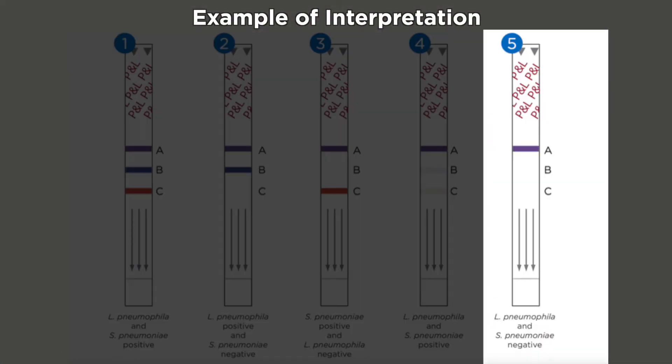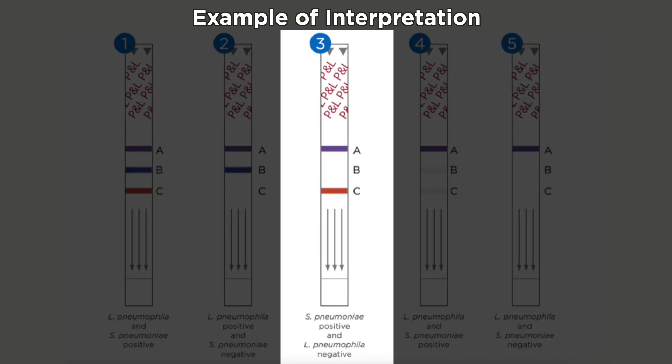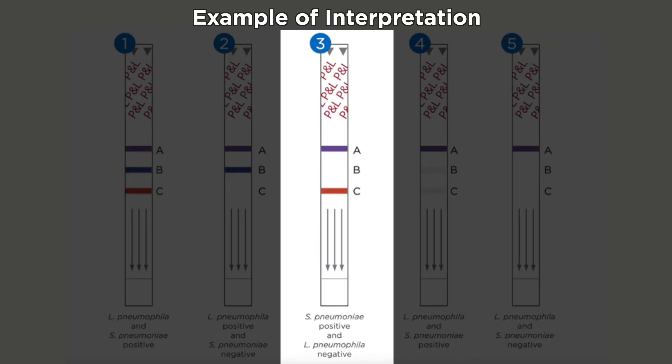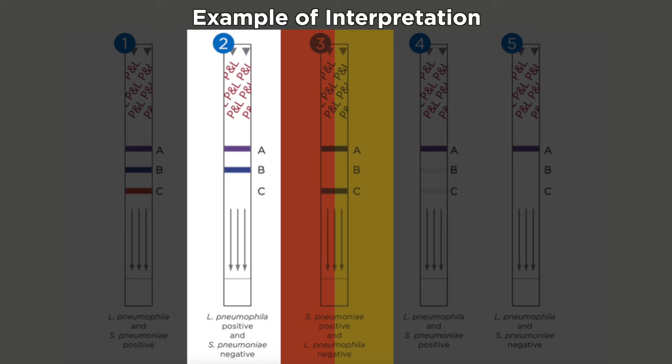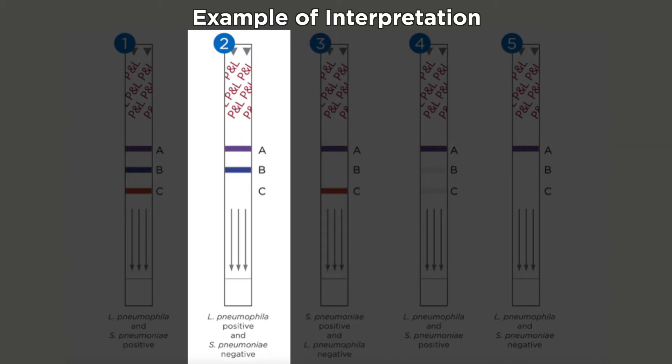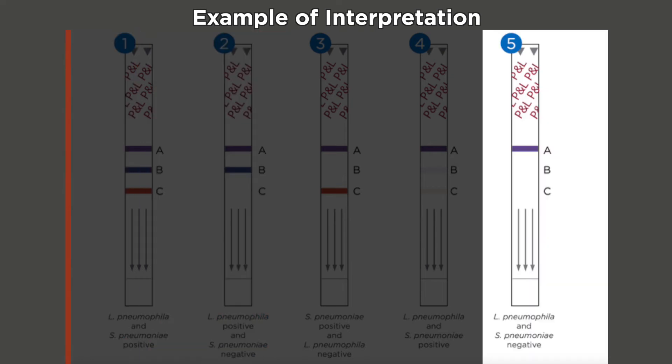First, ensure the test is valid by determining whether there is a control line. A positive S. pneumoniae test has a control line and a red line. A positive Legionella test has a control line and a blue line. A negative test will only have the control line.